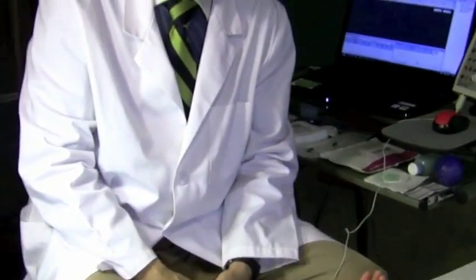This way we know what we're stimulating and what we're recording. Of course, the reason we do all of these things is to investigate the symptoms that the patient has. Most patients come with carpal tunnel, low back pain, neck pain, diabetic neuropathy, and so forth. So we need to isolate some of these nerves that give us the biggest bang for the buck.